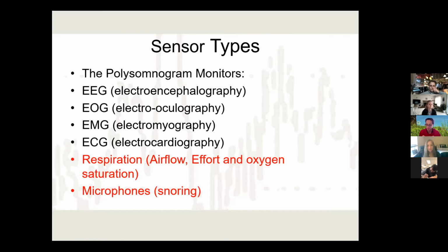Today I'll just be going over a normal PSG hookup that participants would wear throughout the course of the study. On the first night of the study, we will do a sleep disorder screening, and that involves extra sensors that look at respiration, snoring, stuff like that. But we'll leave that for a later presentation and just go over the basic PSG hookup today.